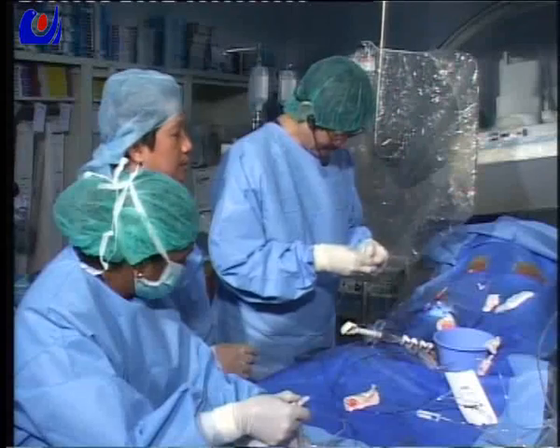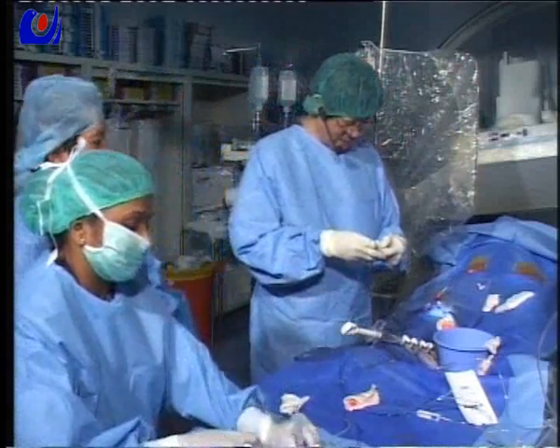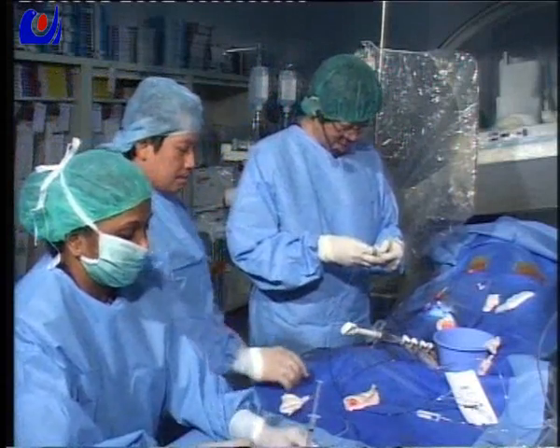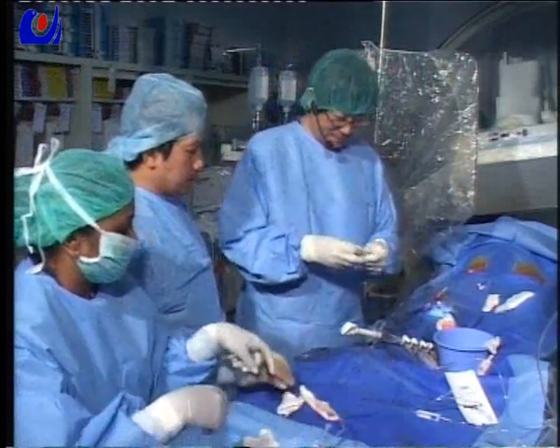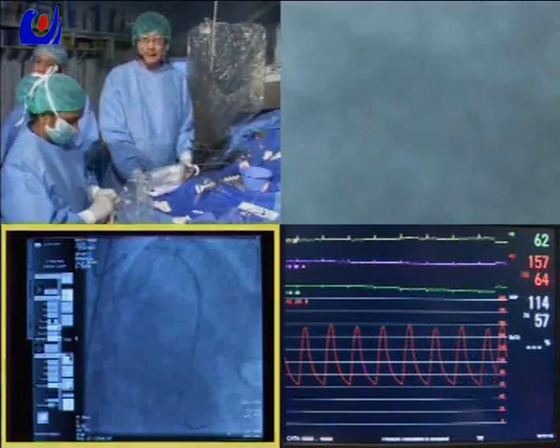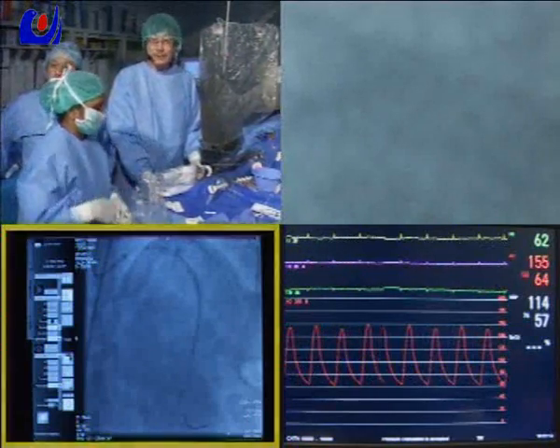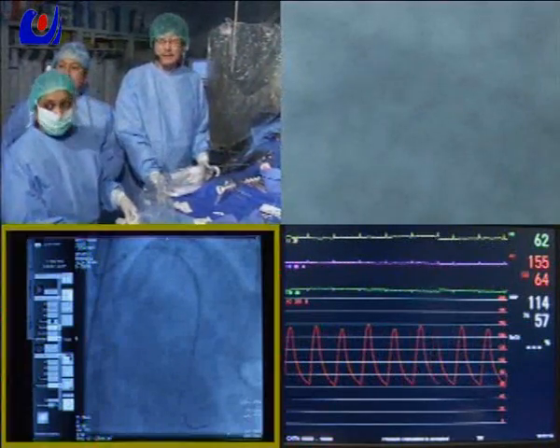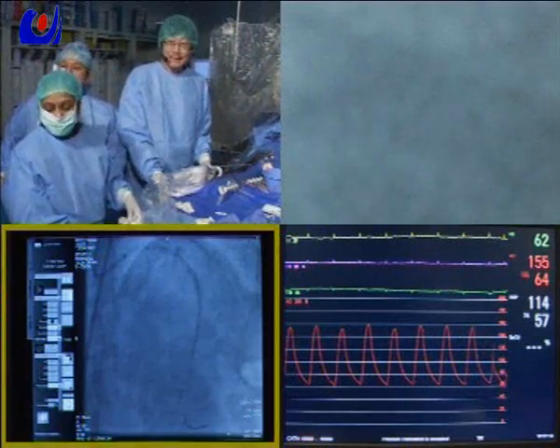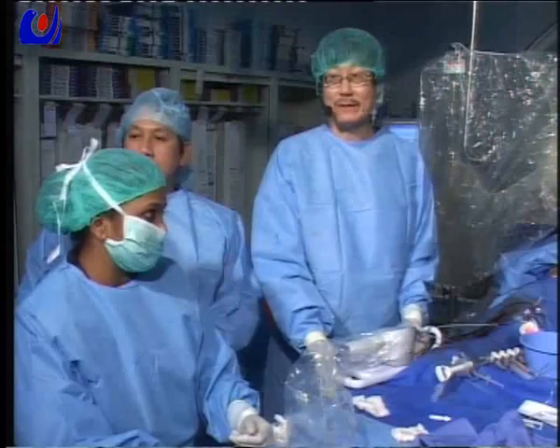So what's the plan now? Yes, just IVUS, the RAD. Then probably, if you allow me, I would stop here. According to the IVUS, we calculated and dilated the lesion 2.5 for the distal and 3.0 for the proximal, and the first stent 2.5 by 38 Promus Element. This is the longest stent we have here.